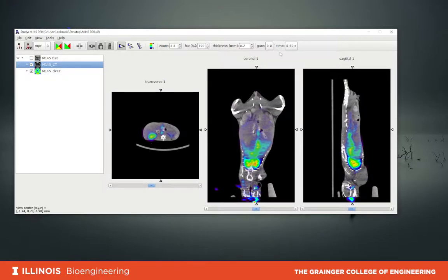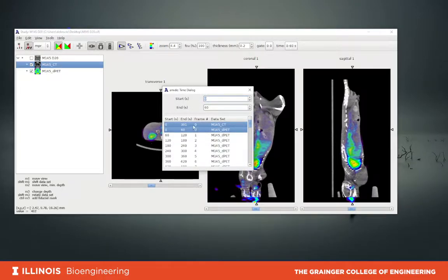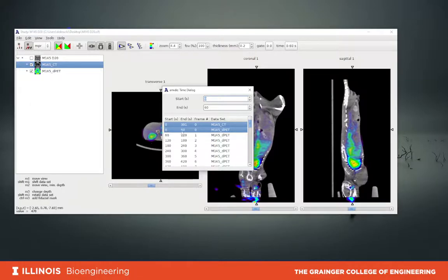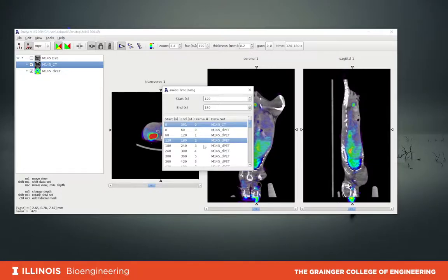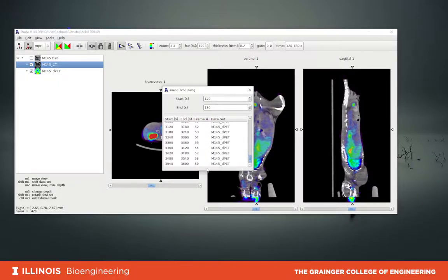You can see the information on the tab here — it shows the time. When we click on it, it shows two datasets: the CT and the PET. Right now it has selected the first frame, frame zero, from time zero — from the start of injection up to 60 seconds after injection. The next frame runs from 60 to 120 seconds, then 120 to 180 seconds as frame two, and so on up to frame 59, giving a total of 60 frames spanning from frame zero up to one hour.